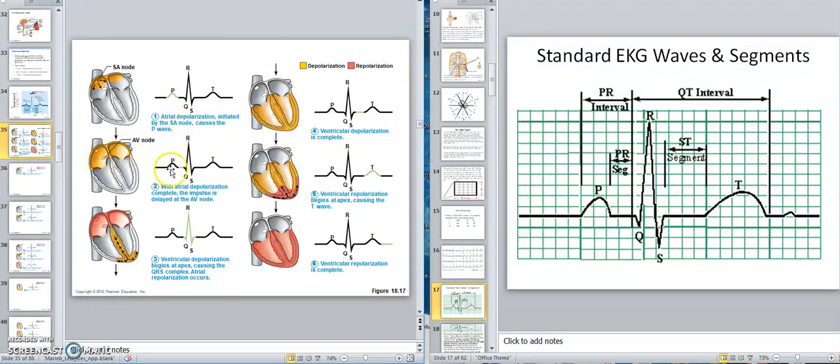So that segment that you see here would be the AV node doing its activity. Then what's going to happen is we're going to pass down the bundle of His, bundle branches, and go to the bottom. As I alluded to, it all starts at the bottom. So that would involve the QRS. The difference in deflections would depend on you going down, then up. So that's where that QRS, which gives me ventricular depolarization.